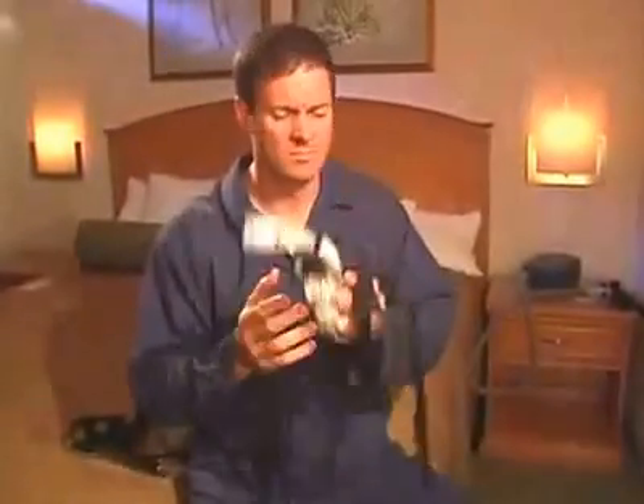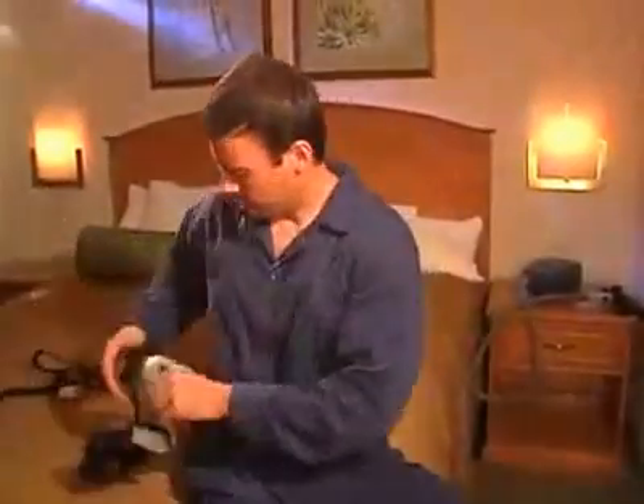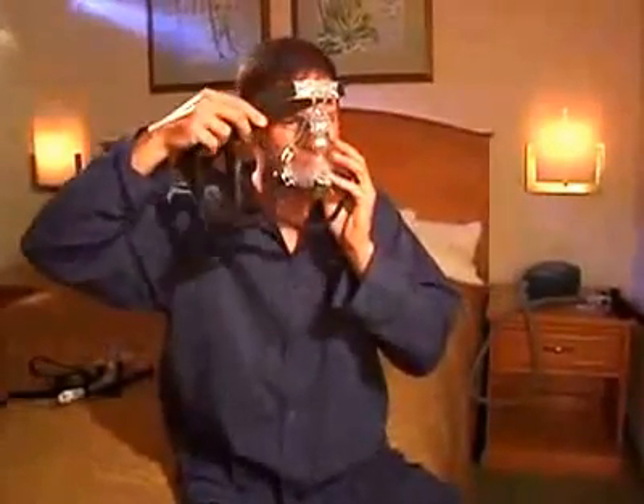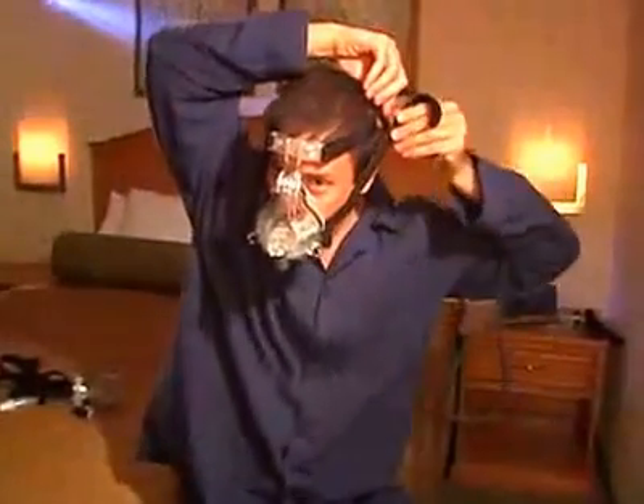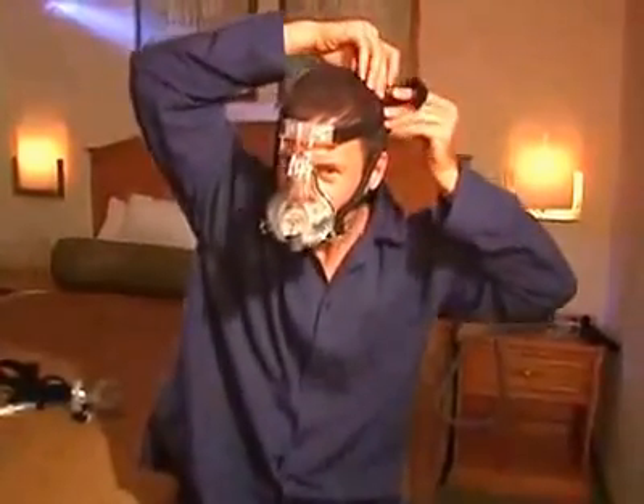Traditional masks have a bulk of material and components that are over the nose, near the eyes, and on the forehead. Often additional accessories are required that can further complicate your experience with the mask.